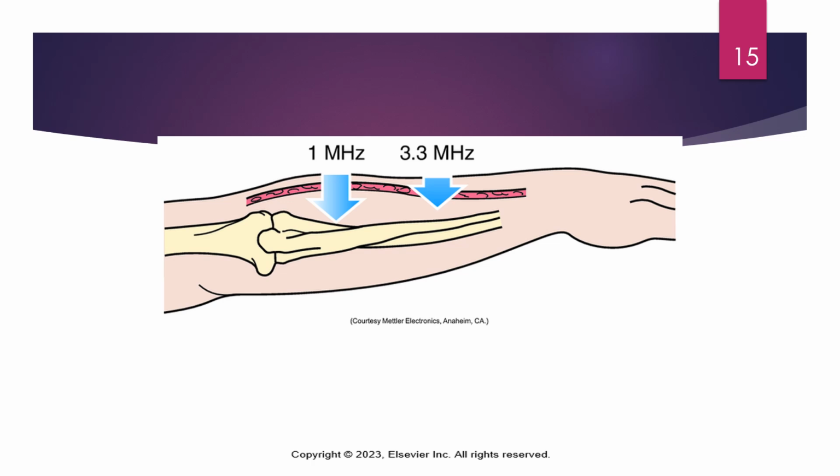Let's say we're trying to get close to that radial head. We're trying to target ligaments and tendons surrounding that radial head. You can find it fairly easily if you come just inferior off that lateral epicondyle, and you can find the actual head, which is a little bit superficial. You can go there, but beware that you're going to get quite a bit of reflection, because we're going through muscle tissue and then hitting bone tissue after we get through that muscle. That may cause those standing waves that we talked about, creating hot spots.